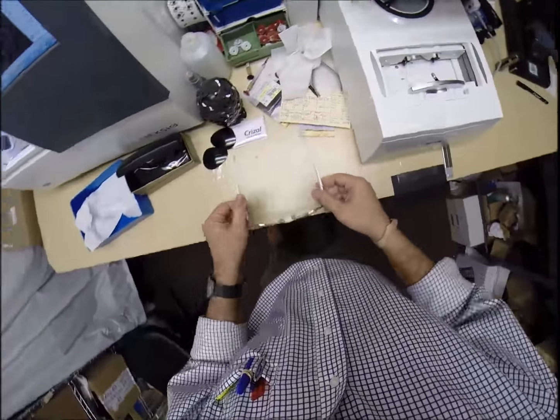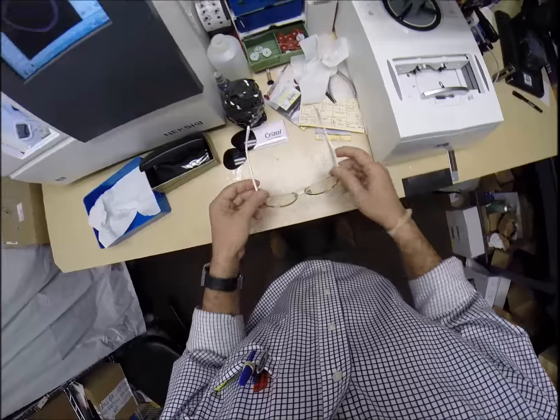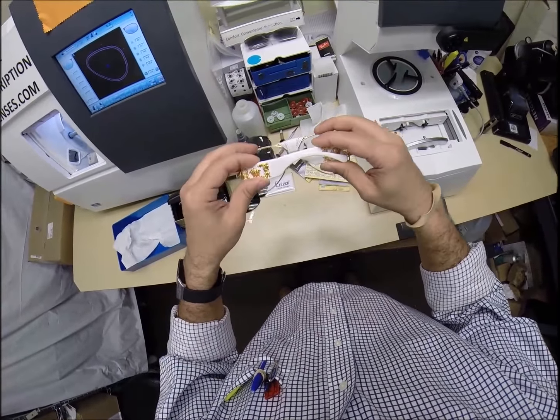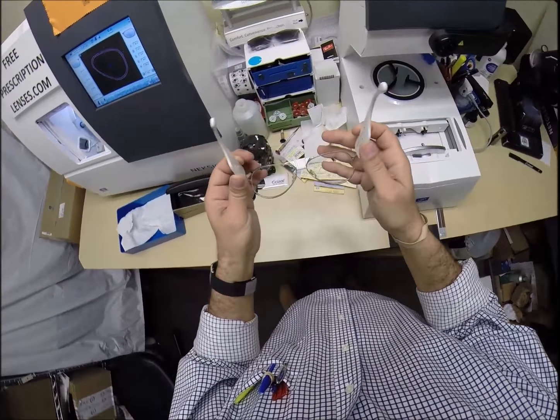I'll stop. So, flip it over, press down, there is no wobble, close each temple to make sure they overlap perfectly, and they do, that neither temple is askew. Same amount of tension on each hinge.